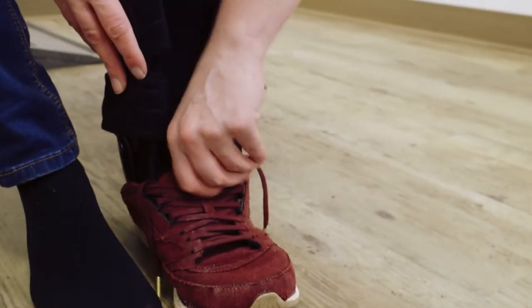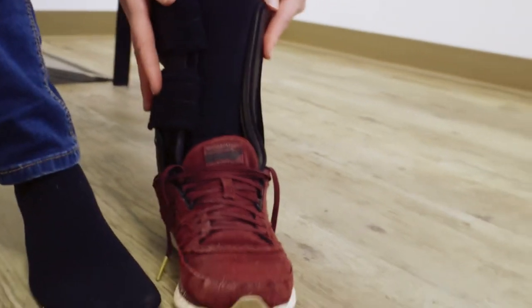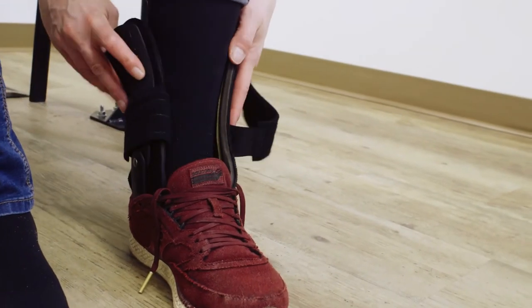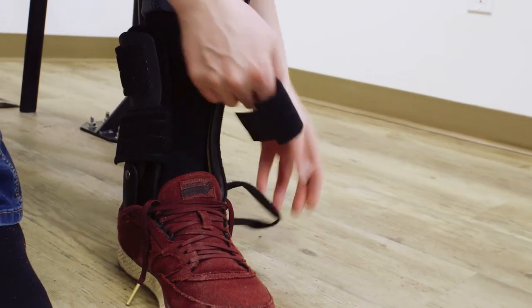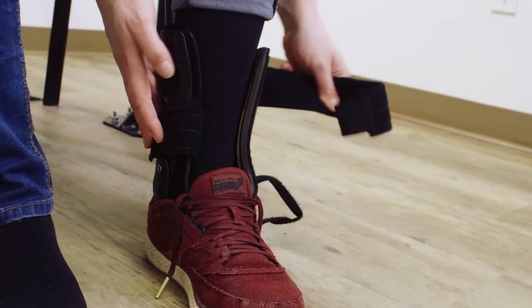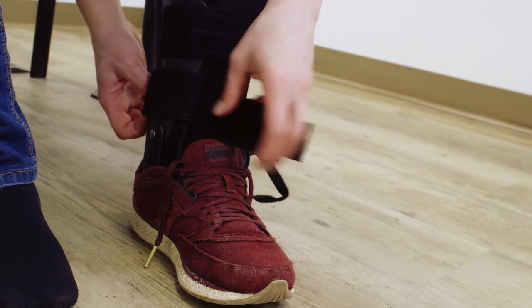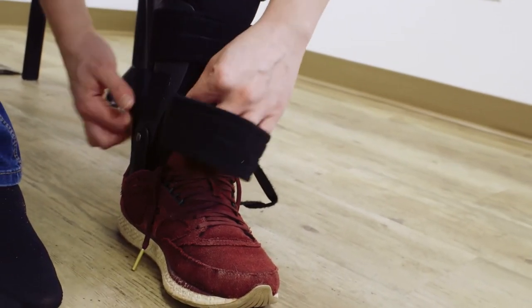Okay, so you put your foot into the brace. Now you're going to make sure that it goes on both sides, so you're going to wrap it around. Undo the straps — it's easy if you can do one at a time so they don't get all messed up. So you put it in nicely and centered and then you just wrap it around. Maybe don't let the other one stick underneath, but hey, you know.